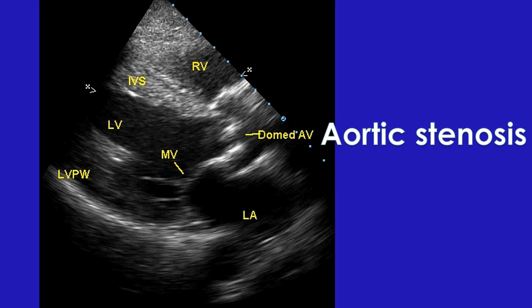Stenosis can be graded as mild, moderate, and severe depending on the severity. Area of the narrowed valve may be mentioned in certain cases. Regurgitation can be graded as trivial, mild, moderate, and severe. Trivial regurgitation, as the name implies, is usually ignored, especially in relation to the right-sided valves, pulmonary and tricuspid. Pressure gradients across the valves will be mentioned when the valve is narrowed. The gradient increases as the severity of the narrowing increases.